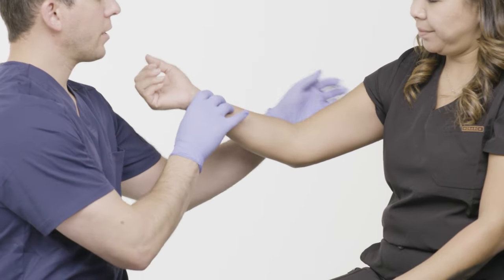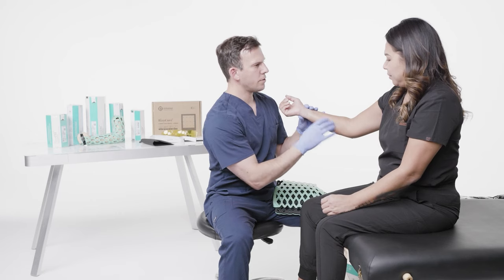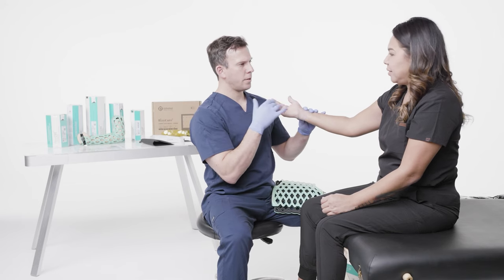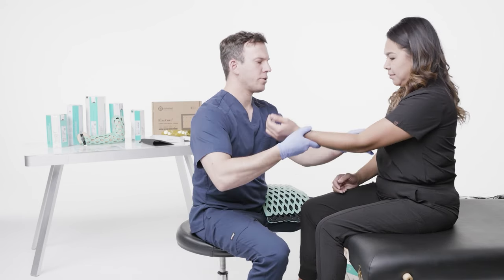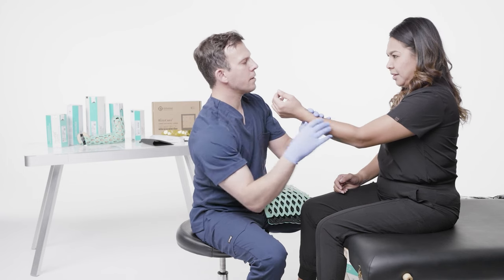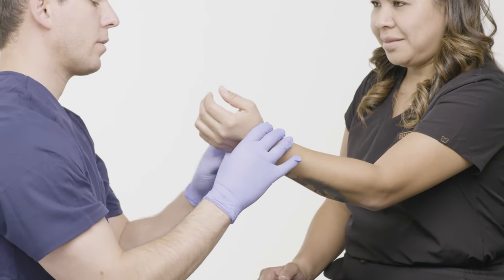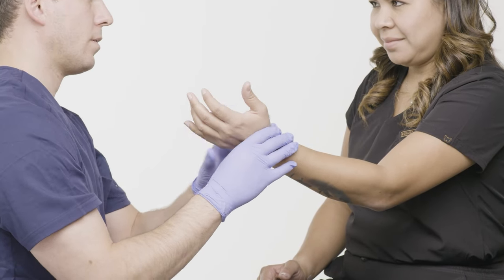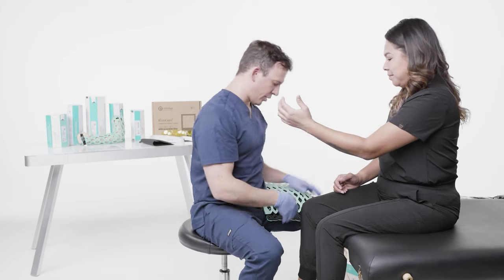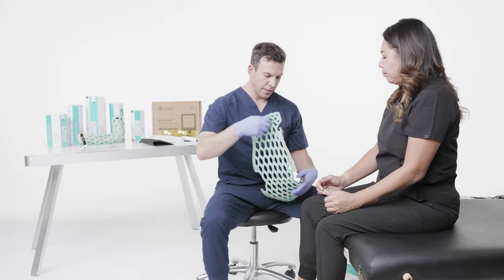I perform a sensory check — asking the patient if they can feel various points of touch. She is neurovascularly intact on that side, and neurovascularly intact distally. So now I'm ready to apply the long arm immobilizer.